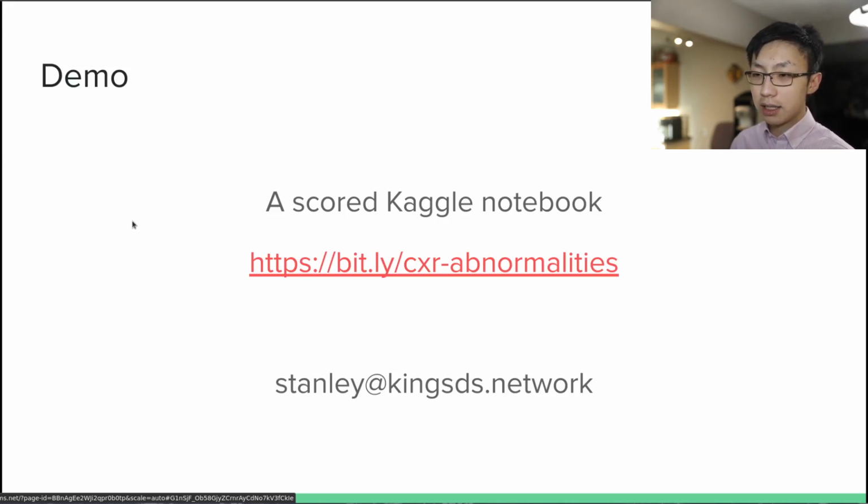Code is at GitHub in our paper. This entire pipeline is inference ready, taking in DICOM posteroanterior chest radiographs, and runs on any CUDA-enabled GPU with over 3.5 gigabytes of VRAM. We also have many other proposed pipelines in the paper for optimized speed or other use cases, so please do see our paper.